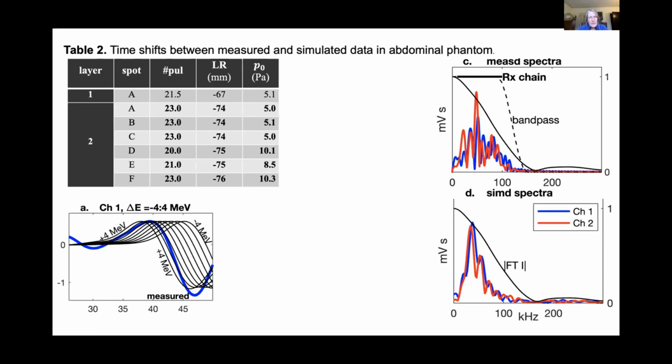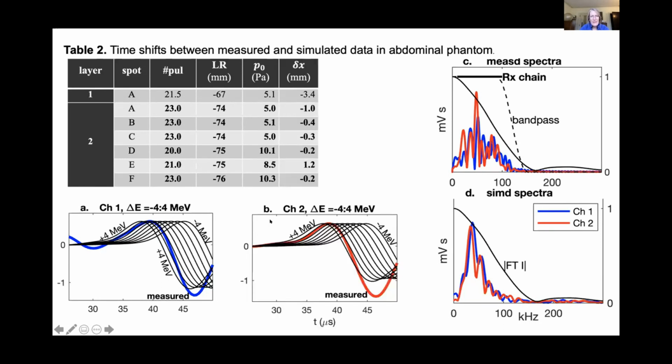And so by interpolating in time, we say, okay, this part of the pulse is rising approximately as the second and third. So we interpolate in between those, just linearly interpolate as appropriate, and also interpolate the Bragg peak locations to estimate the shift, and we do that for both channels. And now my computer's a bit stuck. Oh, there we go. So we did that for both the blue and the red channels, averaged those shifts that we estimated. And when we look here, we've got pretty good accuracy. So the average was 200 microns off of what was predicted for the phantom, with a standard deviation of about 700 microns. Well, 700 microns is much less than the pixel pitch in that planning CT. So I'm quite pleased with that result.